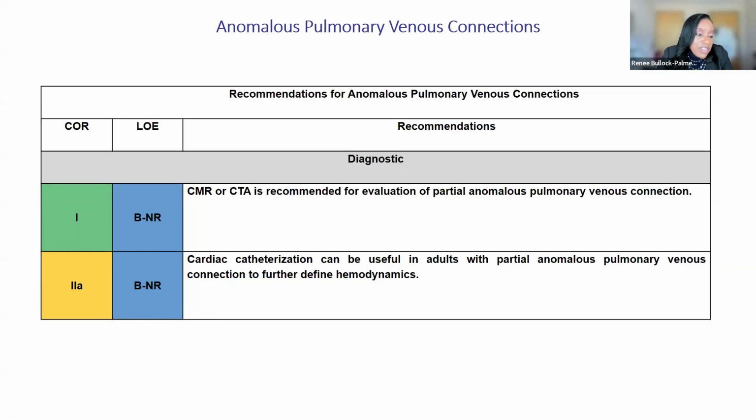Sometimes these patients come to us through the echo lab. You may be imaging a patient in the echo lab, looking at the study. The RV looks very enlarged. The RA looks very enlarged. You're not really seeing a direct interatrial or interventricular shunt. And what you might be missing is a sinus venosus ASD, which is very, very difficult to see on transthoracic echo. Oftentimes these patients are sent for TEE, and even when you do the TEE, sometimes they may have to go to cross-sectional imaging to look at anomalous pulmonary venous return, which can sometimes be missed on echo.